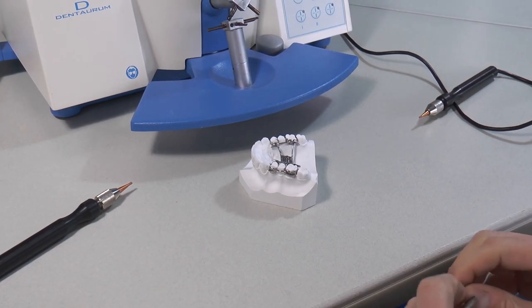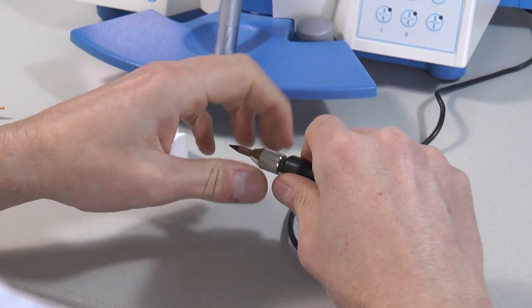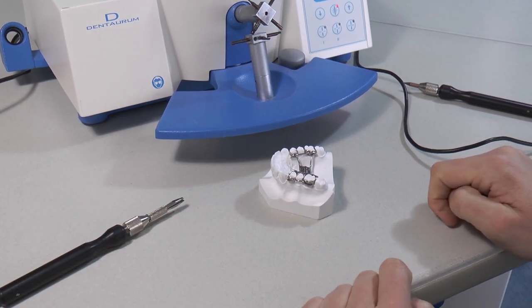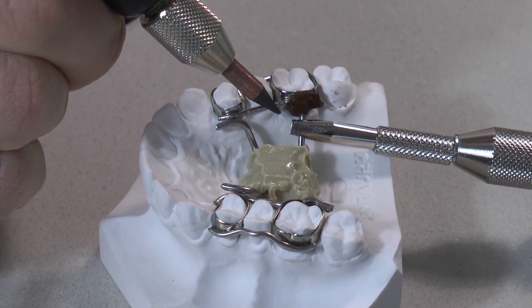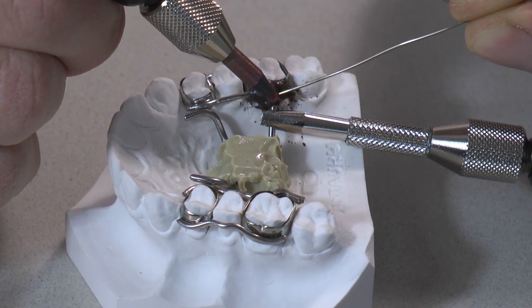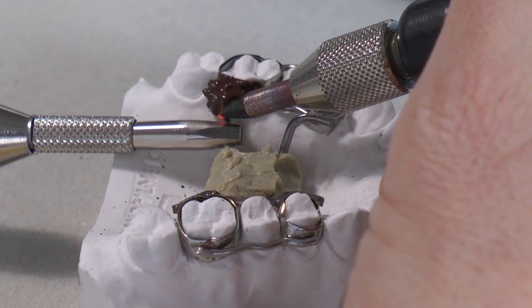Now soldering on a model. Some dental technicians do their soldering on the working model. If you do so, it can be helpful to use the clamping electrode. Switch on the soldering mode and prepare the solder. If you need flux on the wire and it's not in the solder, place the carbon on an exposed area, then press the foot switch, stay in contact with the wire, and move the carbon near the soldering spot.